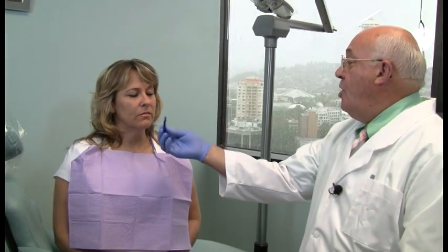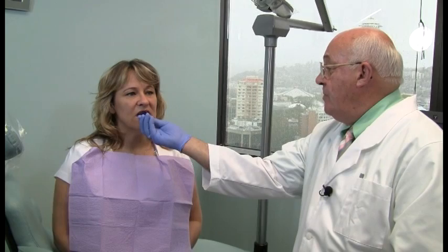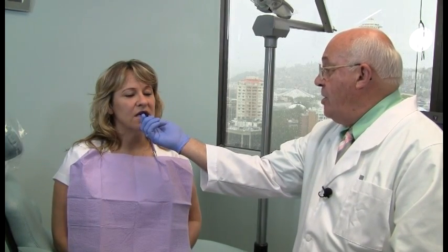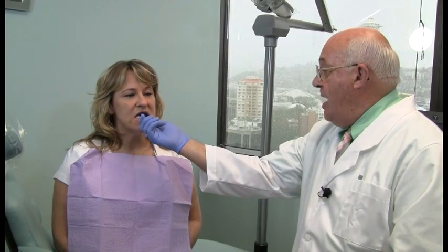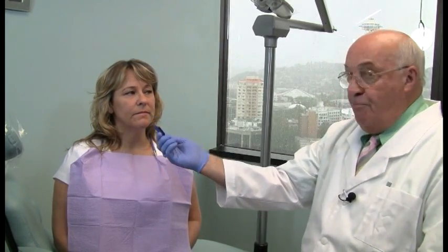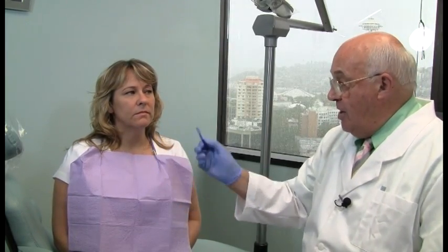And Teresa, we're going to put this in right between your front teeth, 4 millimeters, okay? And then let's slide your jaw forward, and slide back. Now just open, please. Patient gets a feel for how that is on the edges of their teeth. Now how about giving me a good snore sound for a baseline? How about giving me a better snore sound for a baseline? I know you're capable, that's better.